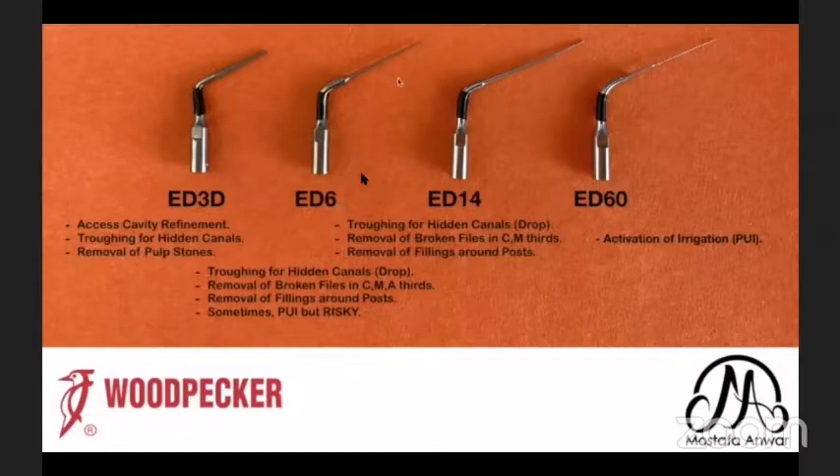The ED6 has an active cutting tip. I can use it for troughing of hidden canals, same as the ED3D, but because it has a pointed sharp tip, you will feel a drop when you find the hidden canal, either MB2 or middle mesial. I can use it for removal of broken files in the coronal, middle, and apical thirds, and for removal of fillings or cement around posts. Sometimes I use it for passive ultrasonic irrigation, but it is too risky.